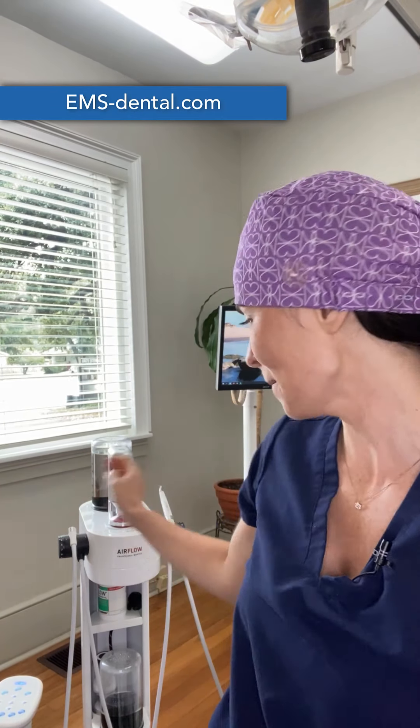Hey y'all, welcome back to another Chairside Chat with me, Michelle Strange. I'm excited because I just tried out the new Airflow Max handpiece from EMS. Before the pandemic, I had become a full-blown GBT practitioner. I love Guided Biofilm Therapy and it has changed how I look at the disease my patients are struggling with and how I communicate with them and how I treat them.